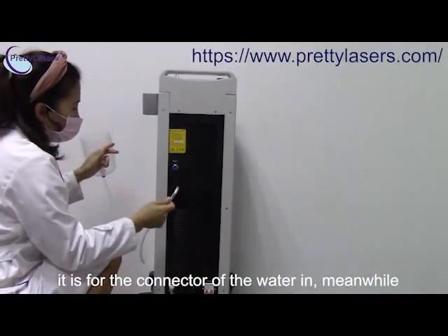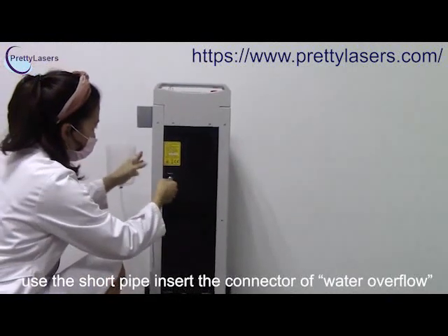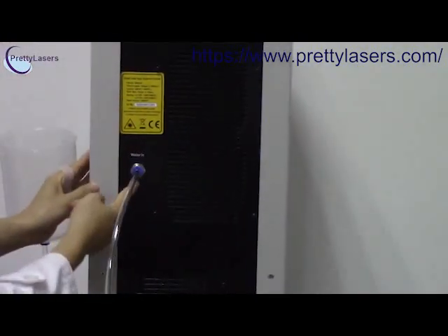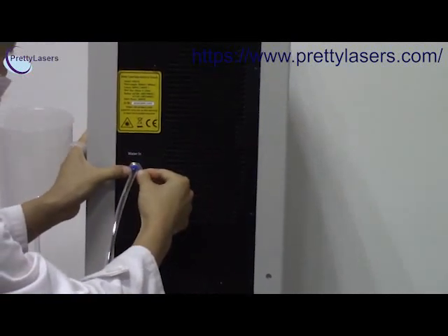Before injecting the water, we have to insert this water bottle into the hole. If you want to remove it, you should also press this blue button first.